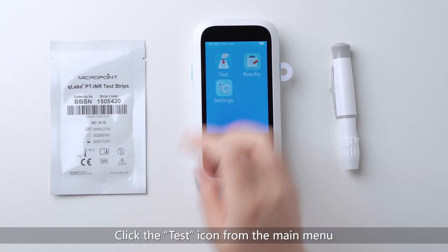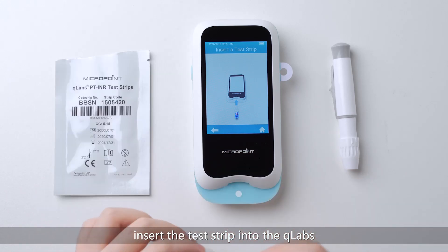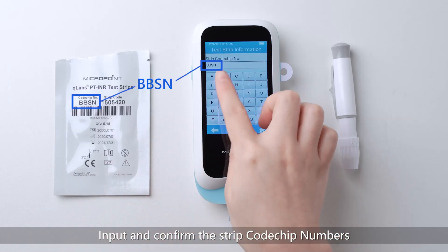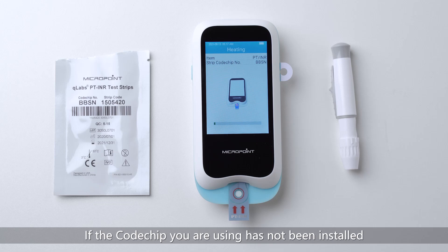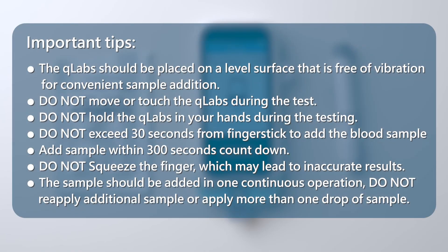When everything is ready, click the test icon from the main menu and insert the test strip into the Q-Labs with the arrow facing up. Input and confirm the strip code chip numbers printed on the pouch, then click Check to confirm. If the code chip has not been installed, input the code chip numbers and install it now. Important tips: place the Q-Labs on a level surface free of vibration. Do not move, touch, or hold the Q-Labs in your hands during testing. Do not exceed 30 seconds from finger stick to adding the blood sample. Add sample within the 300-second countdown. Do not squeeze the finger, as this may lead to inaccurate results. The sample should be added in one continuous operation — do not reapply additional sample or apply more than one drop.